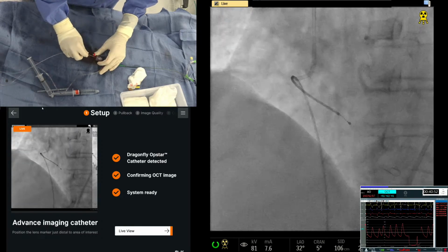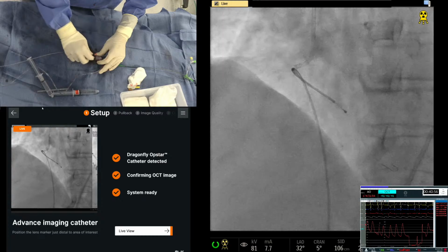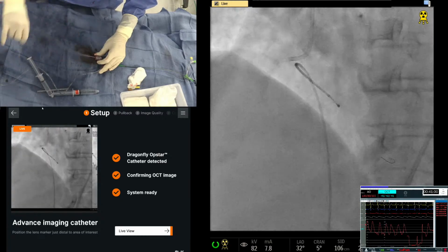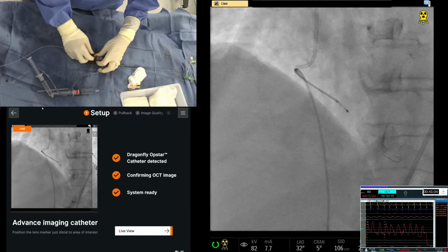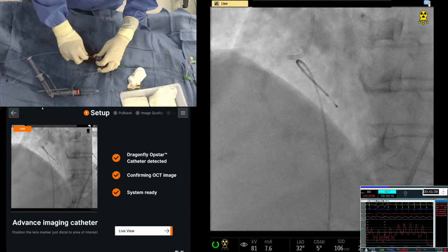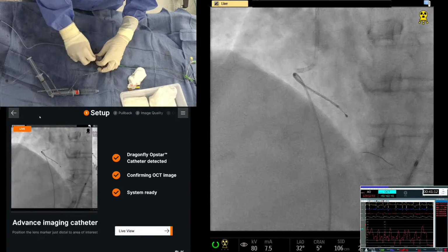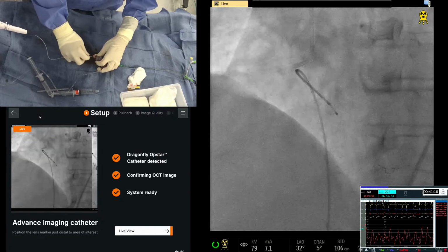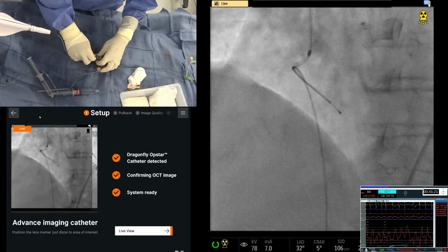The question will come, why did we select this burr? Since the Fine Cross, that is a rule that we follow: if you have any kind of catheter, usually we use Fine Cross here, that crosses the lesion, then a 1.5 or 1.75 burr can be used. If the Fine Cross had not crossed, then we probably would have downgraded to 1.25. It is telling us the lumen is really small.